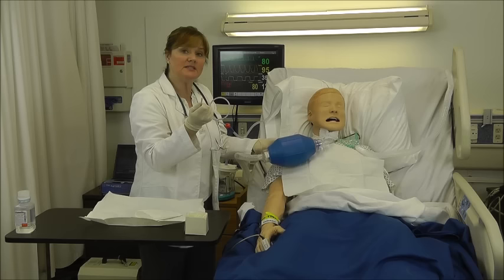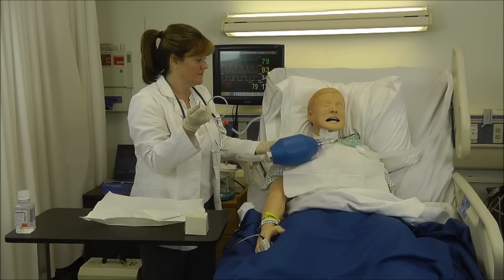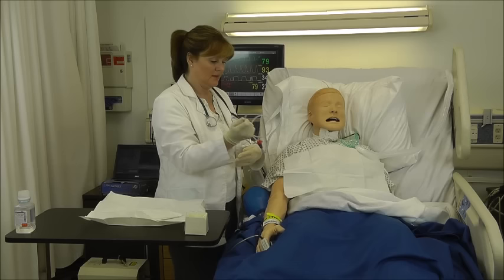I want to do this with his rate of respiration. So when he inhales, that's when I'm squeezing the ambu bag. And his pulse ox has come up. And I'm ready to go down for my first pass.